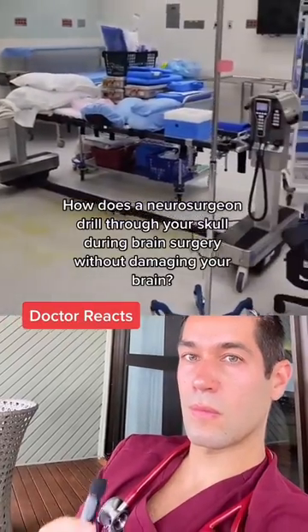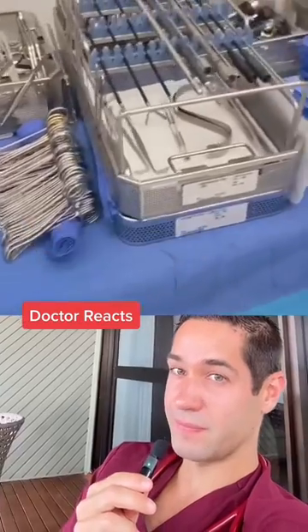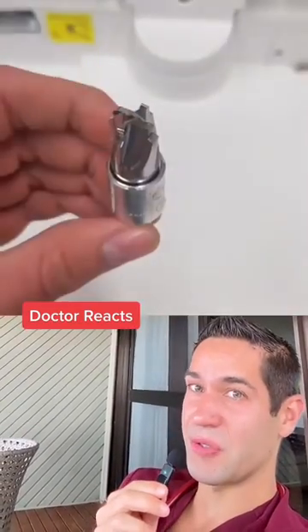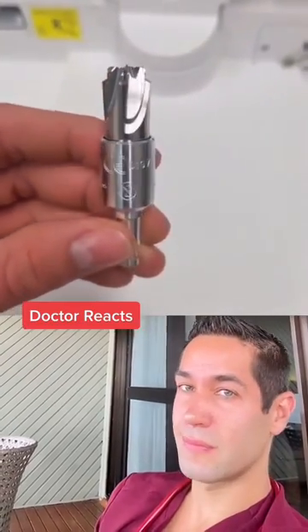How does a neurosurgeon drill through your skull during brain surgery without damaging your brain? The answer is this single-use cranial perforator drill bit, and it has a special mechanism inside that will automatically stop before it reaches brain tissue.